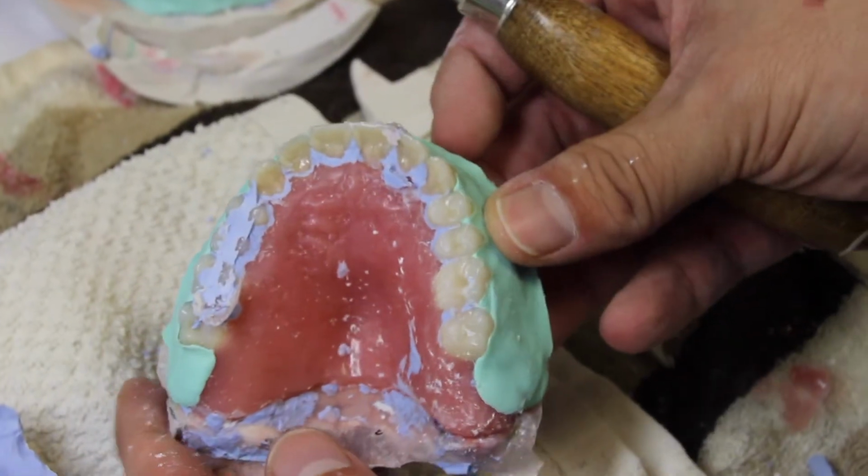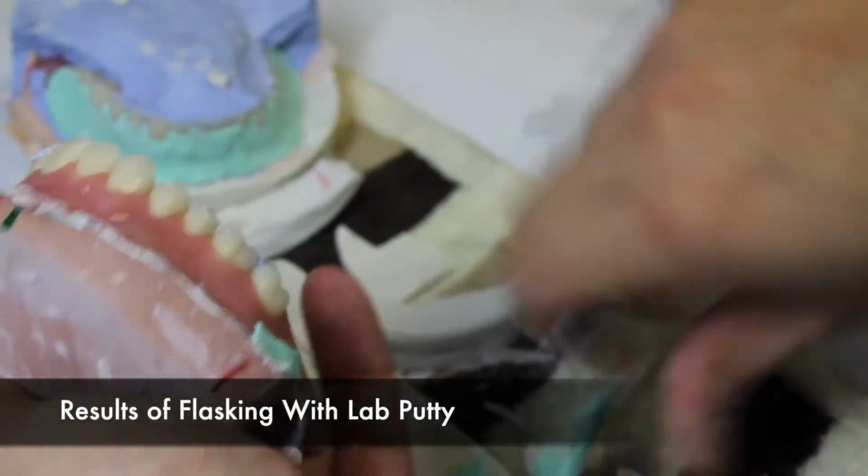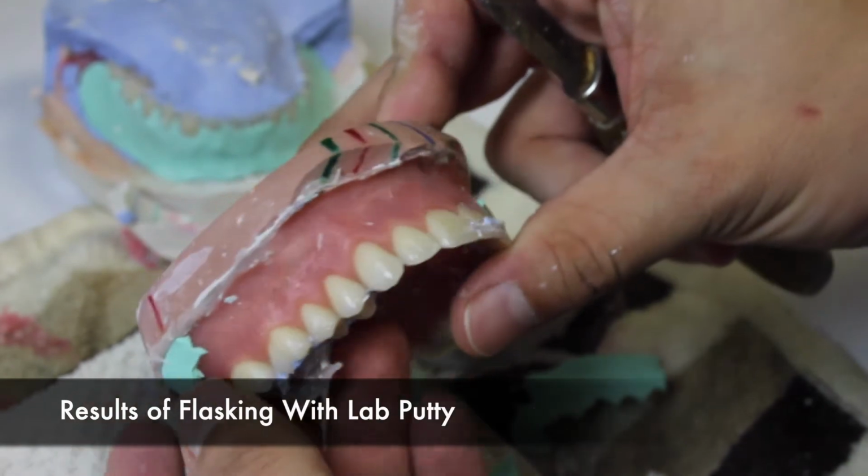Lab putty, although expensive, is a great material to use to capture the characteristics of your wax-up. This is done during the flasking stage. The results of using lab putty are seen here.